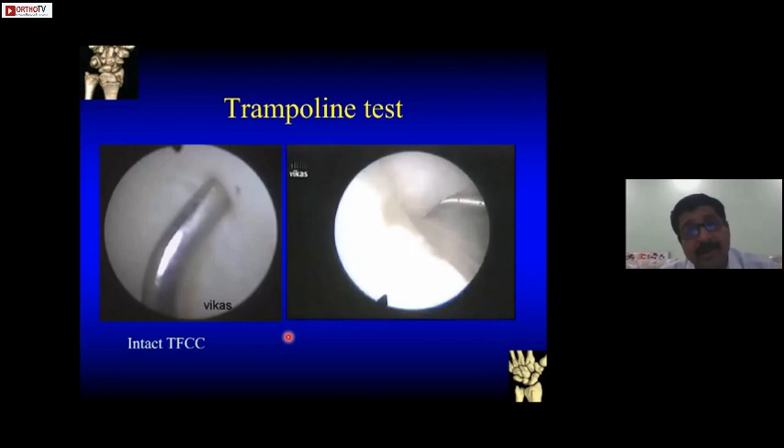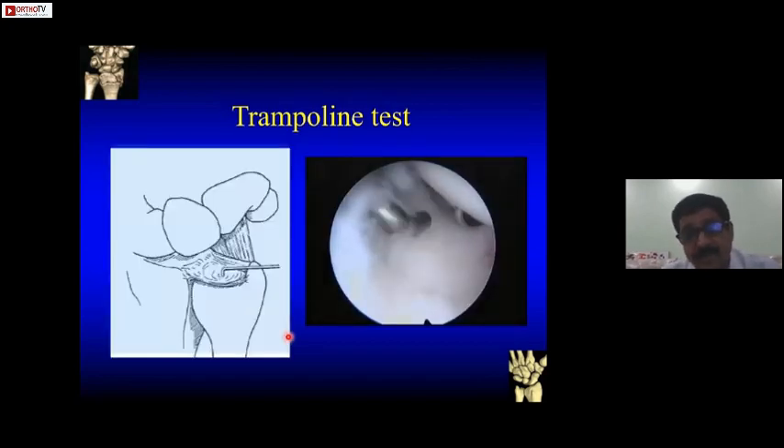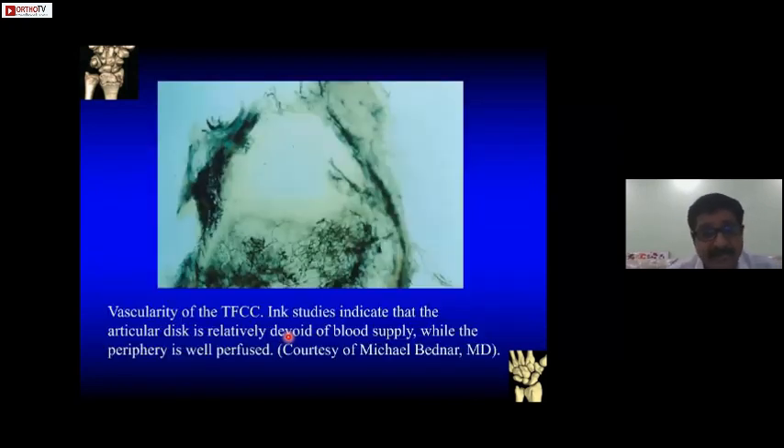Coming directly to the procedure — the trampoline test is where you use a probe on the TFCC. If it bounces back, most likely the TFCC is intact. Studies done in India show that peripherally the TFCC is very well vascularized, so tears in these peripheral areas are able to heal because of vascularity. Tears in the central area are relatively avascular, so even if we repair them, healing is a problem.